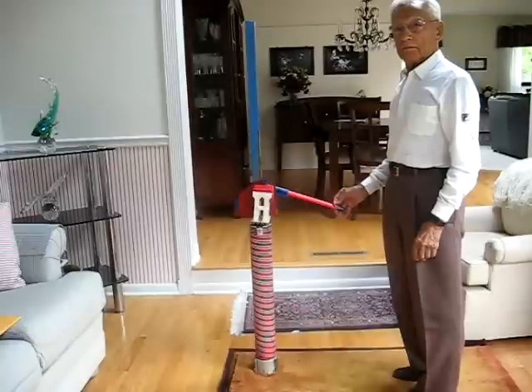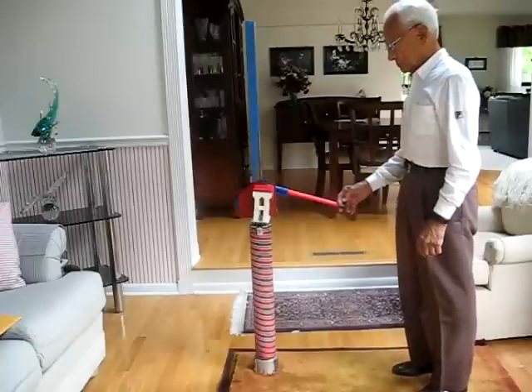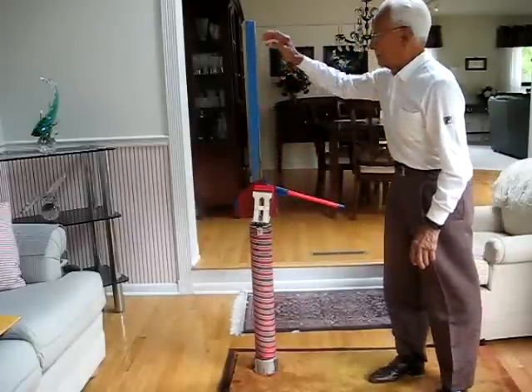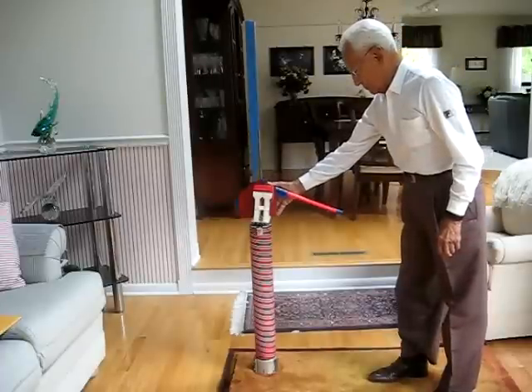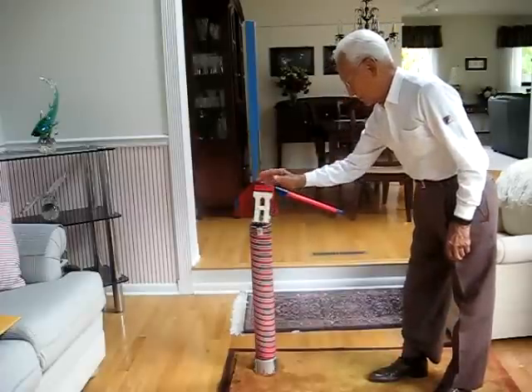Lou made this piece of equipment to stretch the legs, hamstrings, and also to exercise the hip flexors. It consists of a platform with a post. Attached to the post is a jack mechanism operated by a handle, and it has a padded foot holder, which is the white plastic piece that you see.